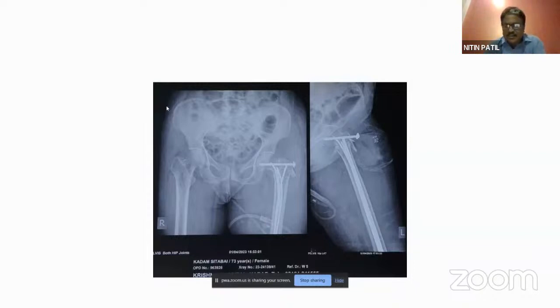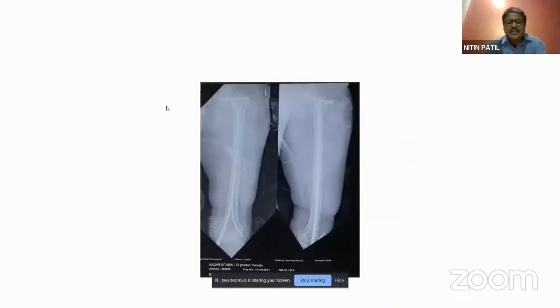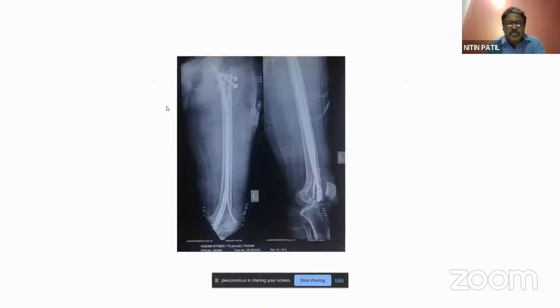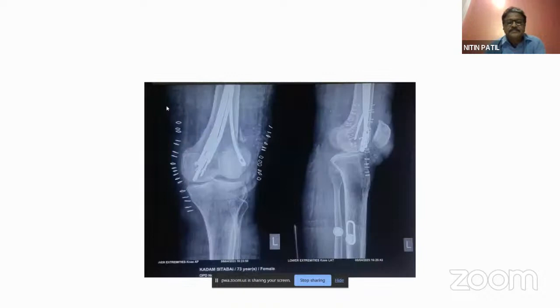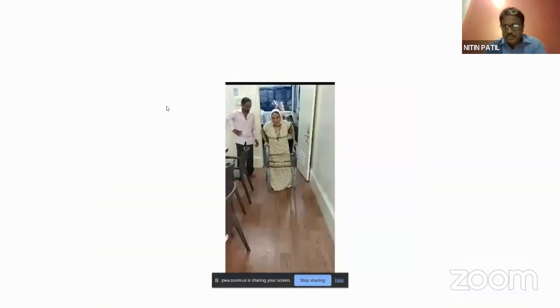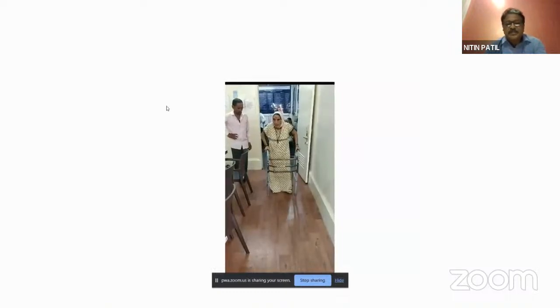Then I tried to revise that. This was the failed fixation. I revised again with Enders nails. So this is the post-op picture, AP and lateral. And this is the 6 weeks, or maybe 4 weeks, post-op picture. The fracture is uniting. And this was today's picture. She was walking comfortably after 6 weeks.